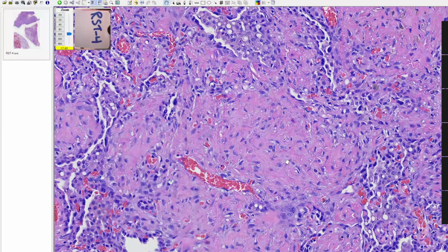And so these are cases that have been progressing over time and are resolving. And so not all organizing pneumonia will go away very quickly. Some of it can persist for some time, and it often has this more collagenous or fibrotic appearance to it. So I just wanted to show that as a case of cicatricial organizing pneumonia.